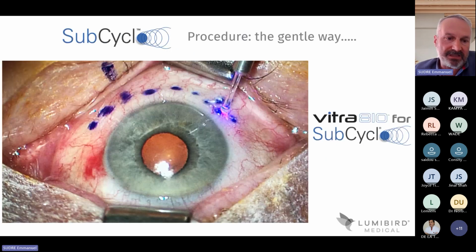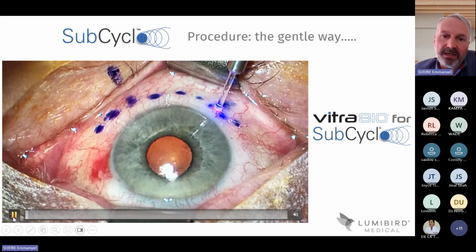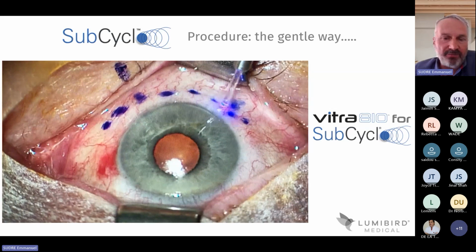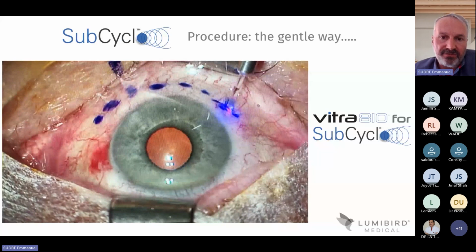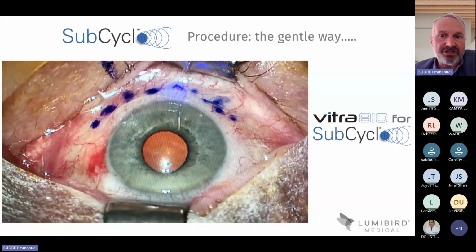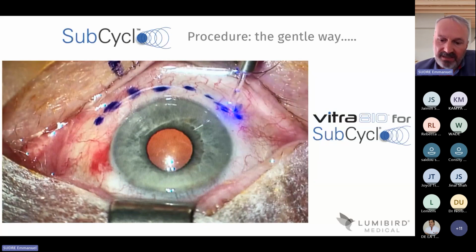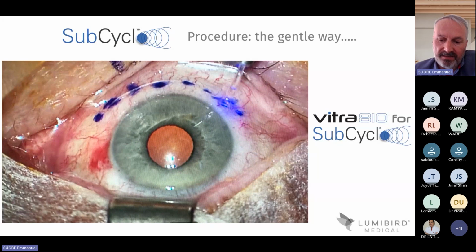Just look at this video showing the technique. We apply a probe slowly by gliding over the sclera, more or less 3 millimeters from the limbus, and we deliver this laser over each hemisphere during 80 seconds, maybe more sometimes. This is a gentle way to treat patients. It is not an invasive procedure. It's quite fast, and it can be done as well in office.